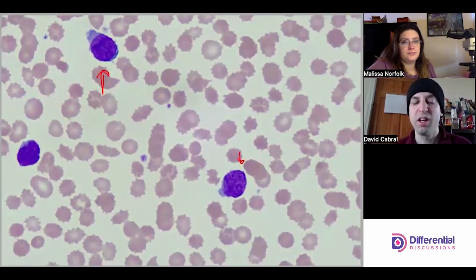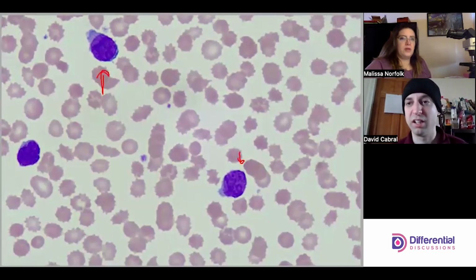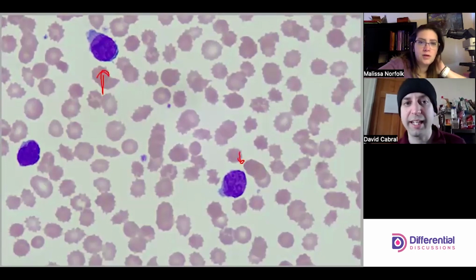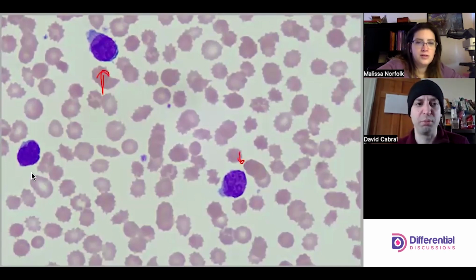So for viewers, take a careful eye to the way the stain is interacting with the nucleus. Don't just blame the stainer. Take that as an evidence piece. That's inconsistent. And then I guess the hardest cell in the field would be on the left there.